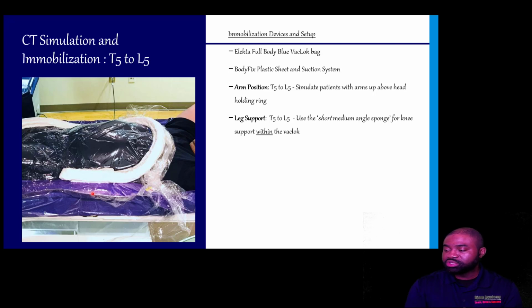Now, the good thing about using the Vac-Lok blue bag is that it is reusable, and so it's really different from the alpha cradle, which is only used once, and so it is much cheaper and more economical, especially for centers with a large patient load.